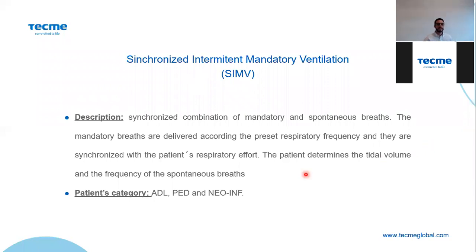Perfect. Next ventilatory mode: synchronized intermittent mandatory ventilation. This ventilatory mode is a combination of mandatory and spontaneous breaths. Here you are setting a frequency which leads to a mandatory breath, okay? And this breath can be delivered by volume control, pressure control, or PRVC, okay?